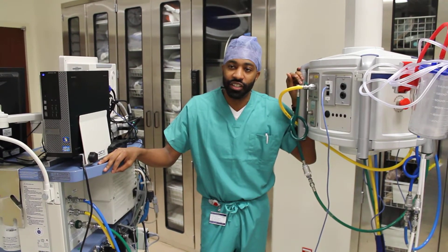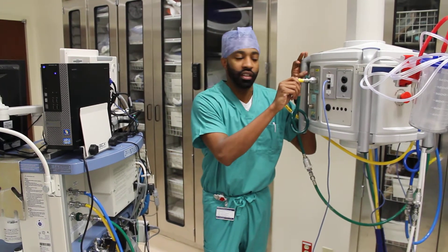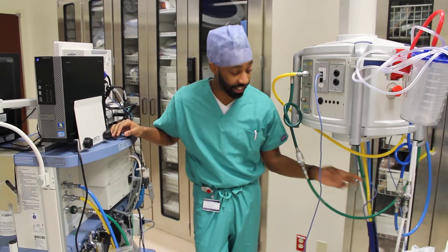Here's your three-minute Drager Fabius anesthesia machine check. First thing we do is check our pipeline hoses to make sure they're connected to the wall unit and secure. They are here. We have oxygen here, air here, nitrous, and our vacuum.